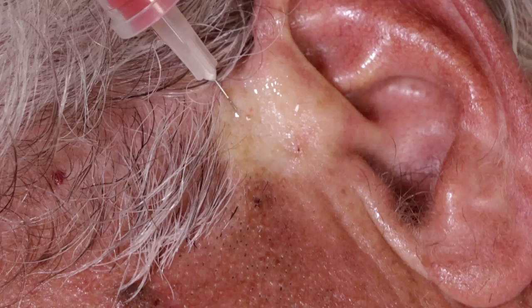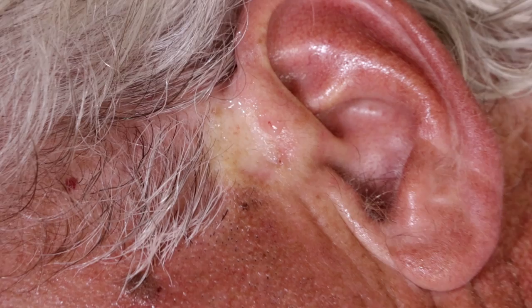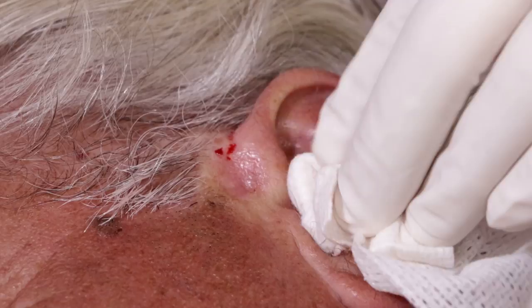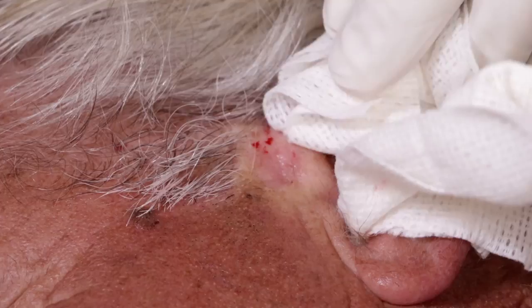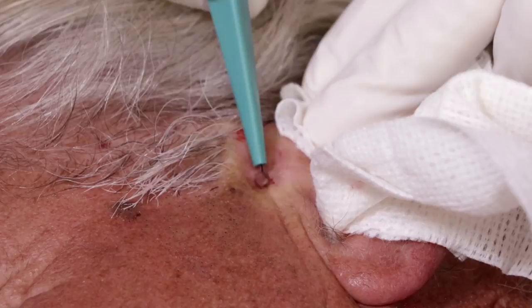This is to keep the blood from blocking the ear, because it will bleed down into the ear canal. The epinephrine is helping to limit the bleeding. Here we go — curettage. It's a scraping, and normal skin doesn't come off.